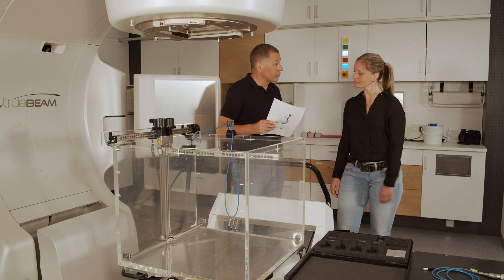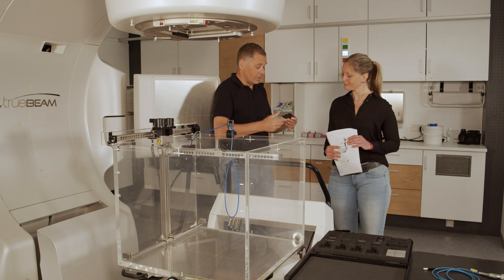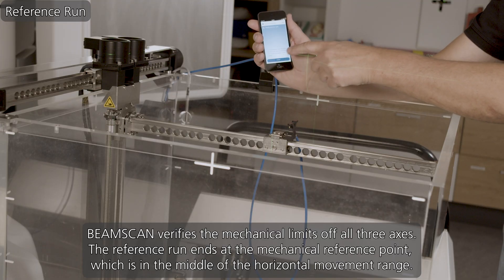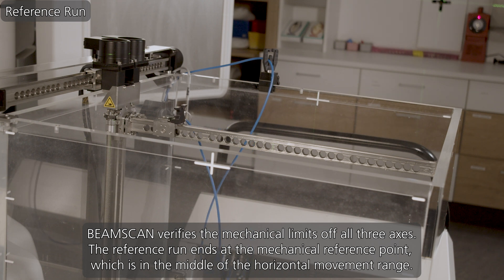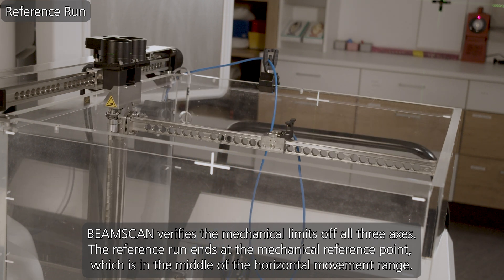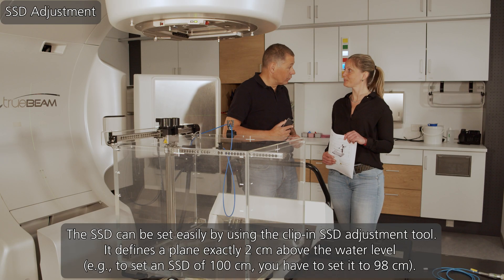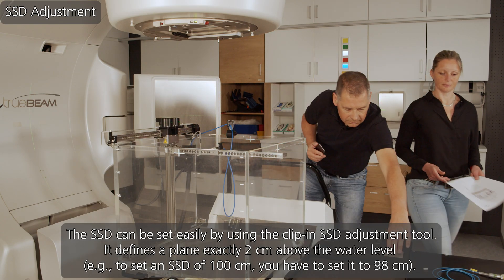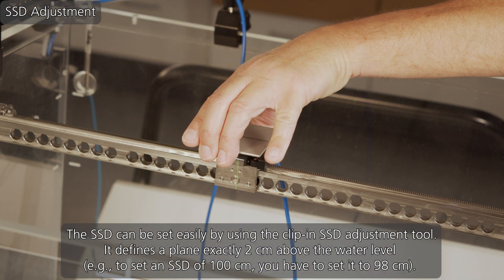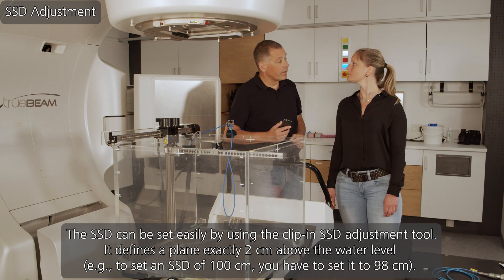I've read that this phantom requires a reference run to know its internal positions and limits. So let's do that. Okay, the next step is to set the SSD. There's a small tool for this. And now we move the crosshairs to 98 to get an SSD of 100.